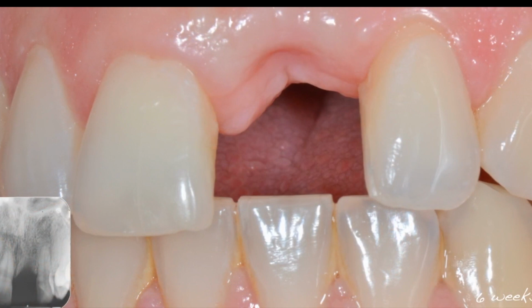This is about 6 weeks later, where the patient came back. She was using a flipper as an interim prosthesis in between. The site has healed. This is the radiograph of the site. We had some soft tissue growth, and since we knew that she had a vertical and some horizontal mainly and some vertical bone deformity, we knew beforehand that she was going to go for an implant plus a bone graft to rebuild the buccal plate.